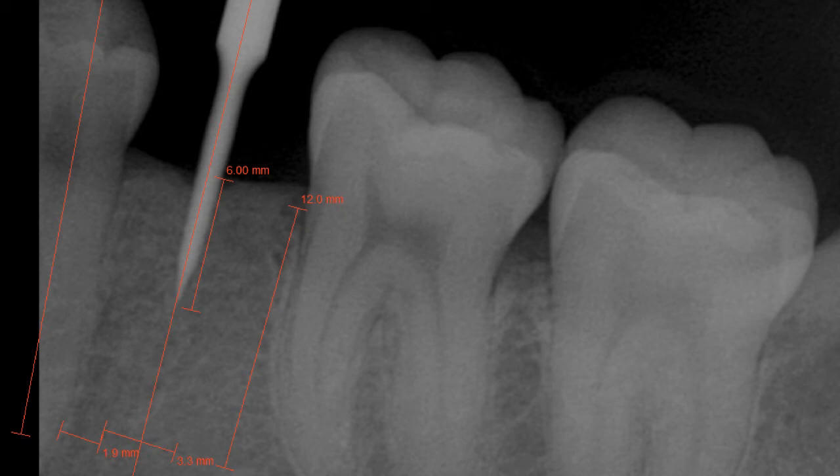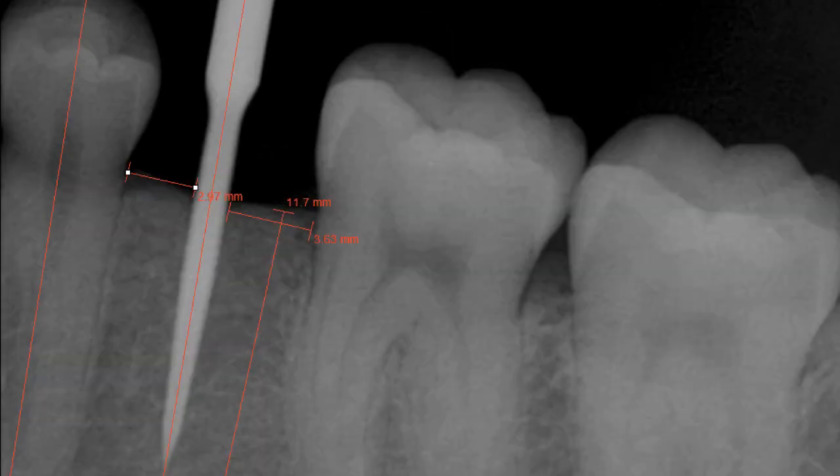On the apical portion here, I made sure that I'm at least 1.5 millimeters away from natural teeth, so that I don't encroach on the PDL of the neighboring teeth. Moving on, I inserted the BTI initiator to the full length of my planned implant and drew the lines vertically to make sure I'm parallel to the premolar.